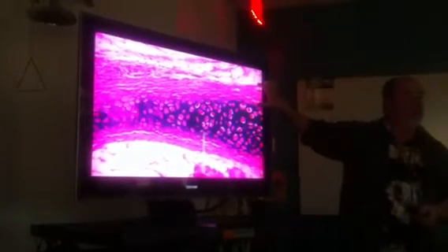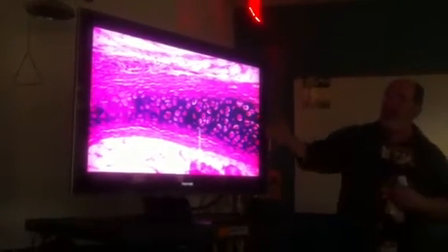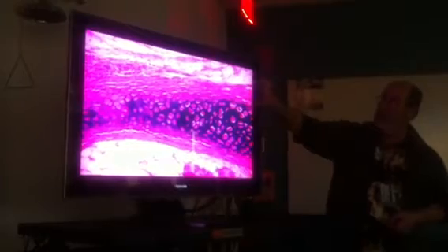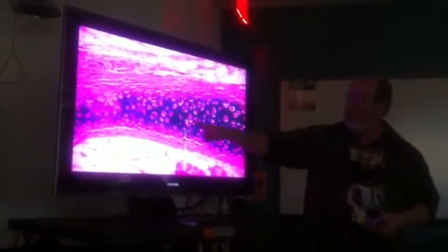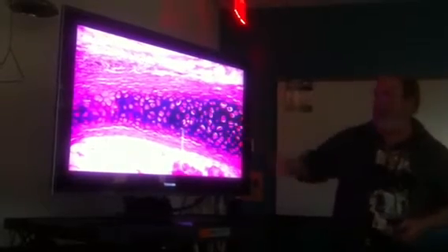Elastic cartilage has two characteristics that are easily used to identify it. One is it has this really thick perichondrium. In both cases, whether you're looking at ear or epiglottis, it's going to have a really thick perichondrium, thicker than hyaline cartilage. And then the other one is all the stain for the elastin in the matrix. So that's pretty easy, right?